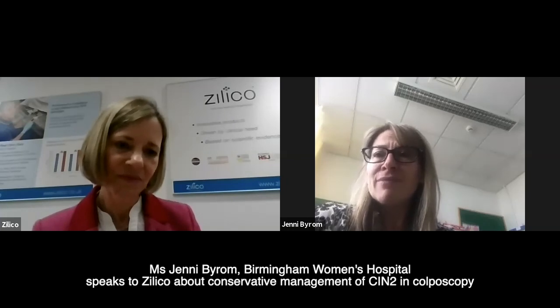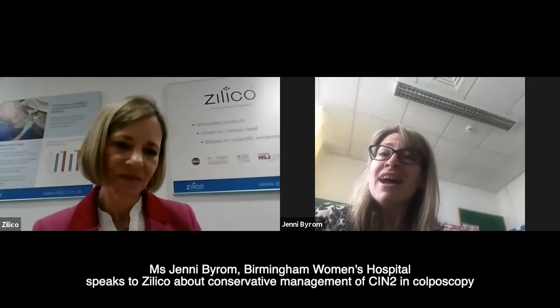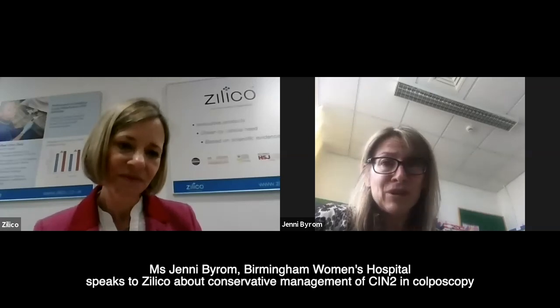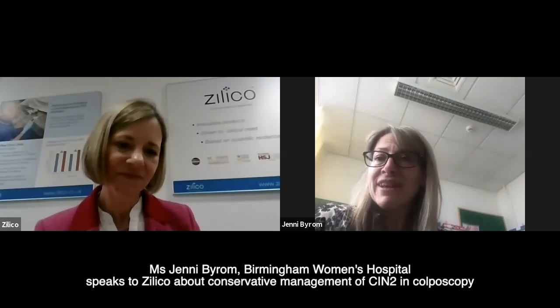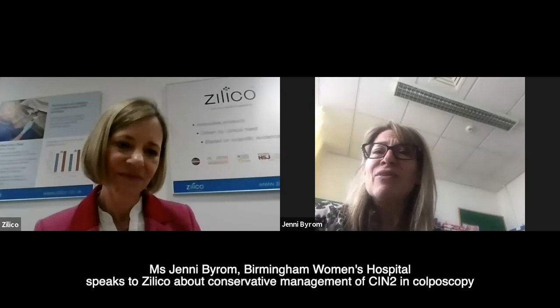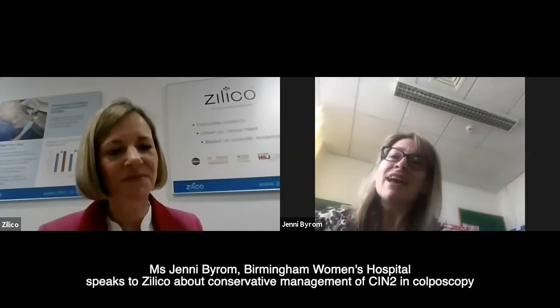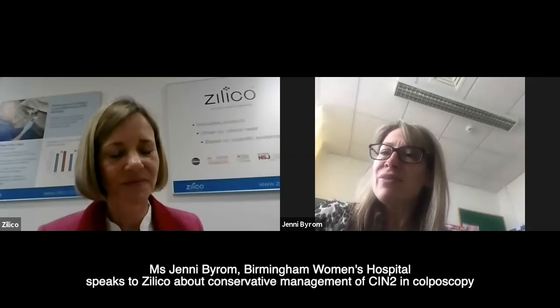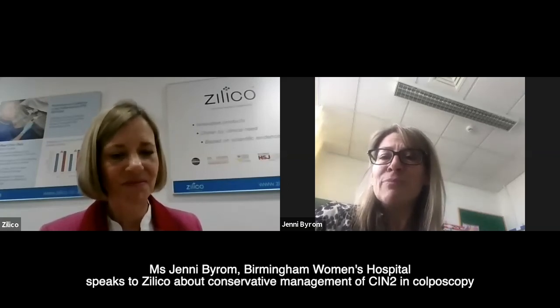So I've certainly had patients where I've done a Z-scan, we've chosen to do conservative management, and then when it's been repeated 6 months later, actually the Z-scan is telling me that there is no high grade disease, and all the points have come back as green, and that's been reflected by an improvement in cytology, and that means also that I'm not tempted to take another biopsy. If the Z-scan picture is improving, then I'm more likely to just wait and see what the cytology shows rather than diving in and taking further biopsies at that point.